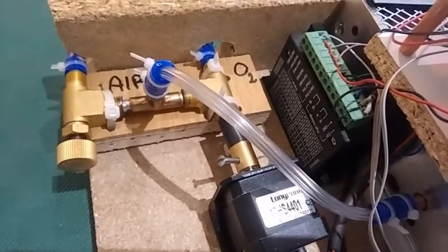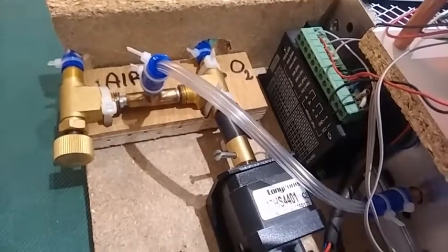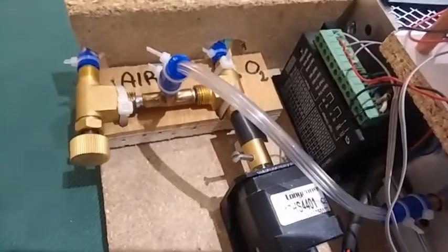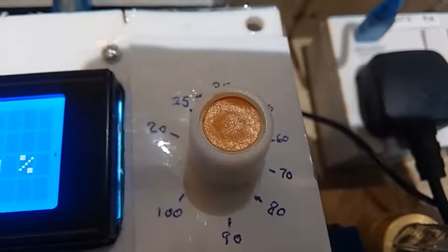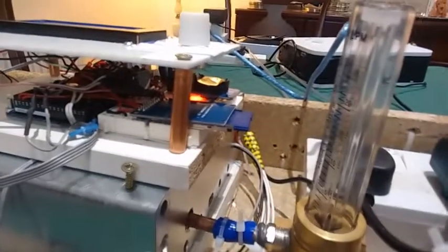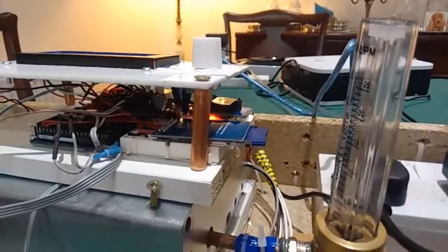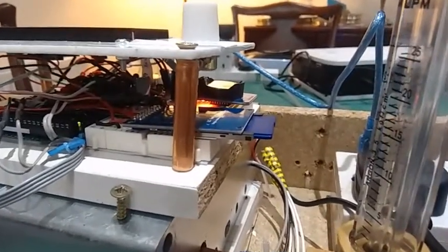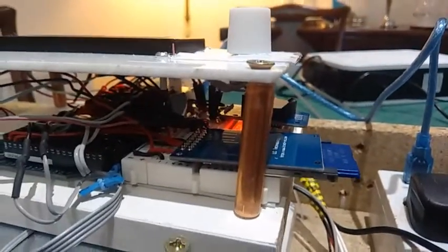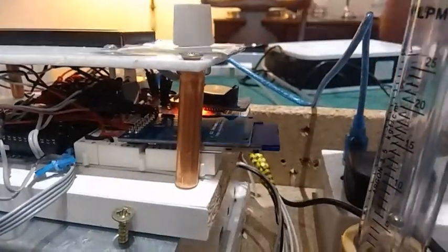The computer alters the valve to provide a higher or lower oxygen concentration according to the selected value. The level of oxygen can be selected by the clinician. The level of oxygen required and provided are documented on an SD card. This is at regular intervals, which can be selected as often as once every second or longer intervals if required, and then can be reviewed at a later date.